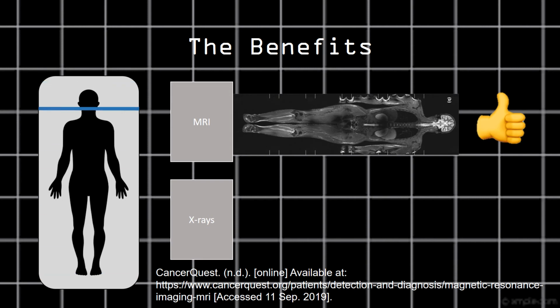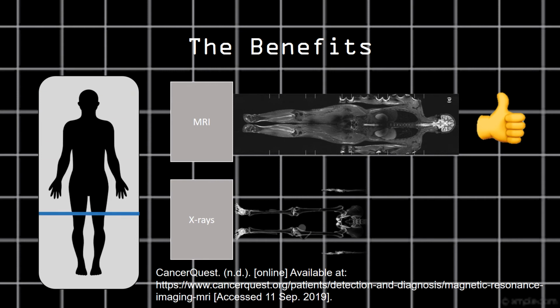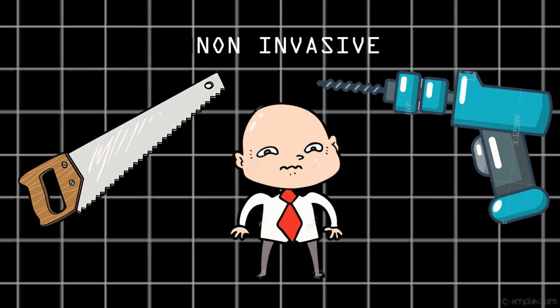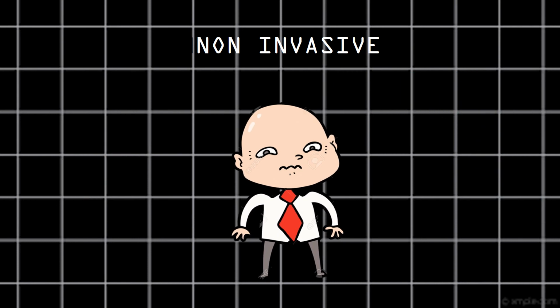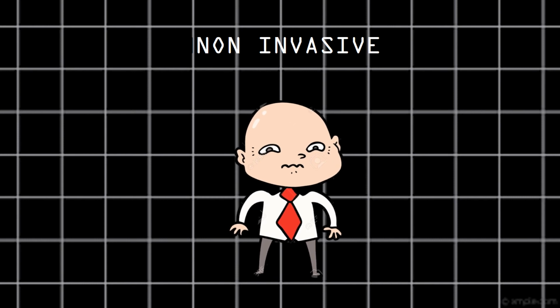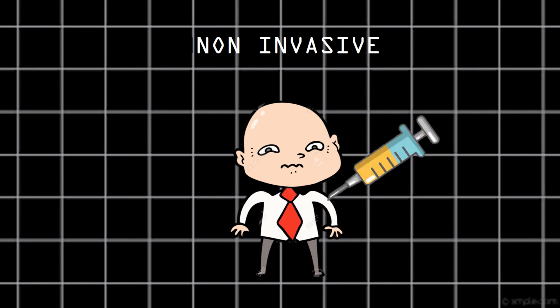While most other medical imaging processes are able to perform scans for these diseases, the process of the MRI and the images that are produced possess many benefits and attributes that other processes cannot achieve. For instance, it is non-invasive, meaning that no instruments have to be in direct contact with the patient, which allows people who have fears of needles, syringes, or any other probe devices to undergo medical imaging. However, in some cases involving the spread of cancer, a chemical agent is injected into the patient to form a color gradient, which creates clearer pictures.